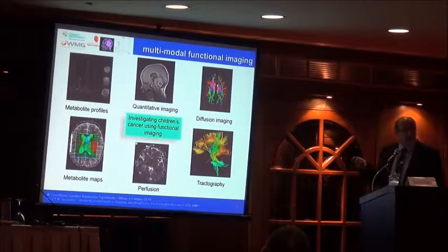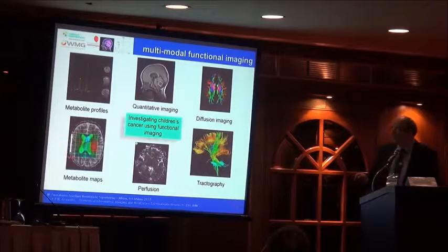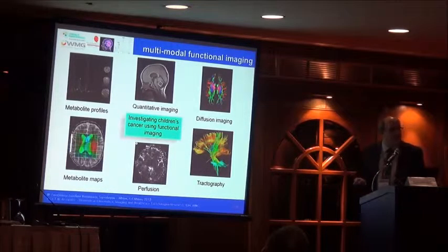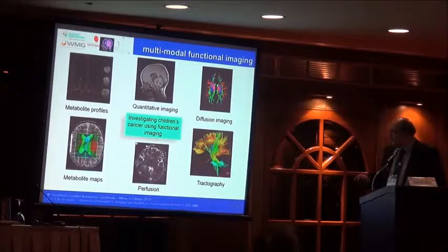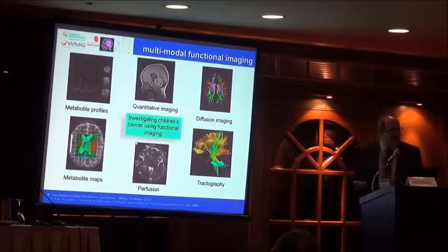measurements. Looking at the properties of water diffusion, so that we understand particular cellularity issues, together with perfusion, where we look at vascularity, and then combine structural and biochemical information into maps that tell us about the metabolism of the tumor, or even we can create, through diffusion, 3-dimensional representations of the tracts of the nervous system.